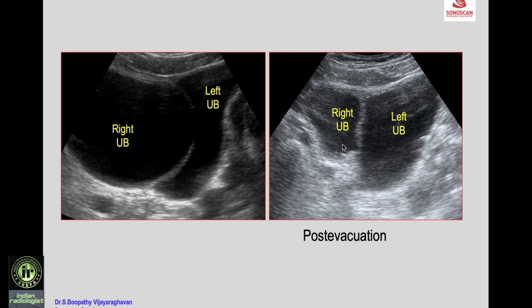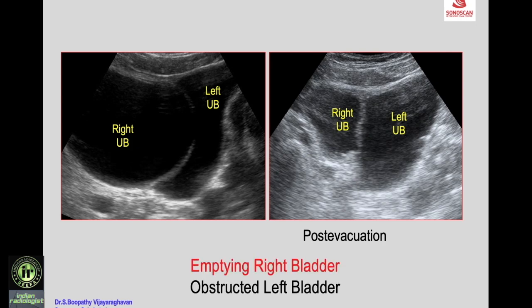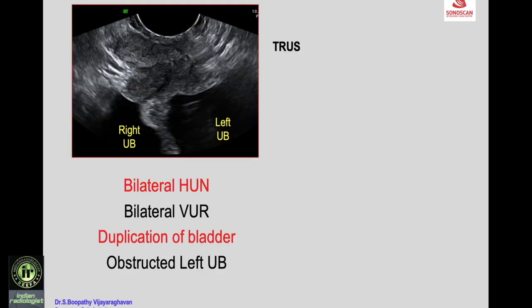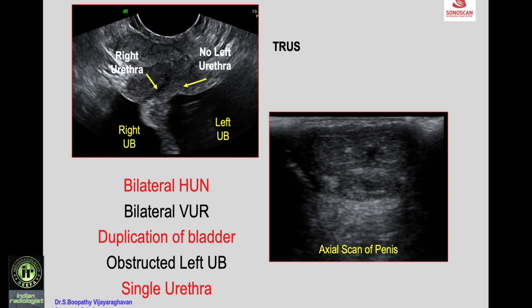After the patient voids, the right urinary bladder empties well, whereas the left urinary bladder has not emptied and appears larger, indicating obstruction. There is duplication of the bladder with an obstructed left bladder. Transrectal ultrasound shows the right urinary bladder continues as the urethra, whereas the left urinary bladder has no communication with the urethra.